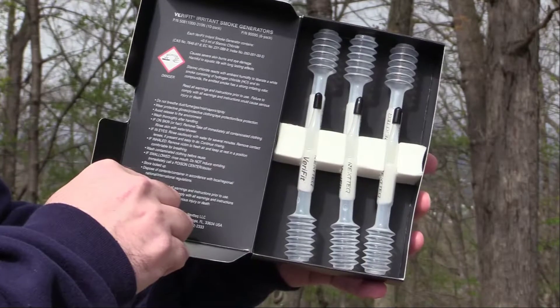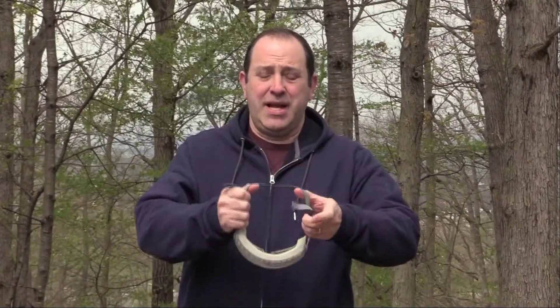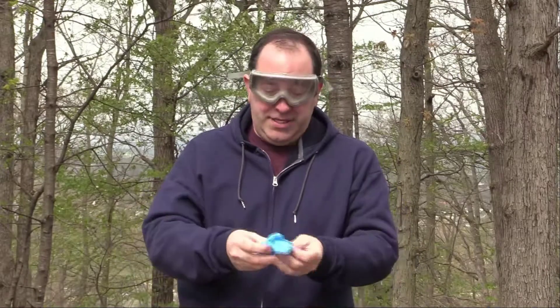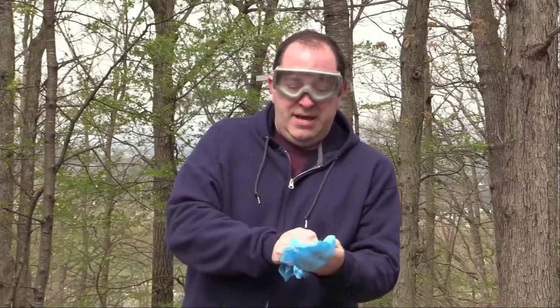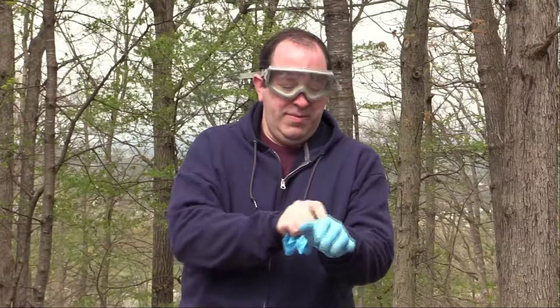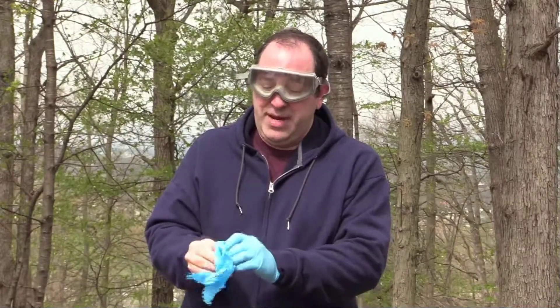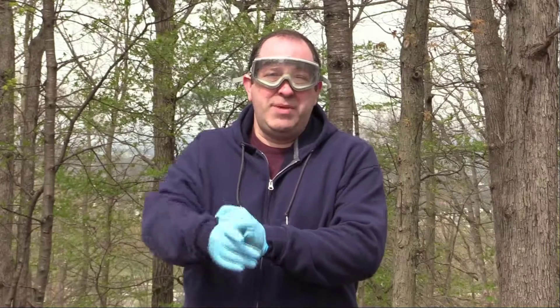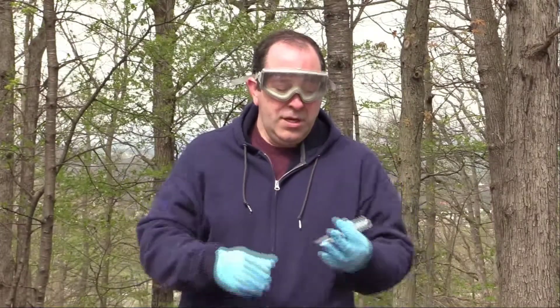These warnings are serious — you definitely want to read the manual before using this equipment. The smoke these generators put out is toxic, so you need to protect yourself. They recommend using goggles that can protect you from fume exposure. It's also a skin irritant, so it's important to protect your hands — I'll be using nitrile gloves. Don't use this in any confined space, don't expose other people to it, and when you're done, wash your hands, wash any PPE exposed to it, and wash the clothes that were exposed.